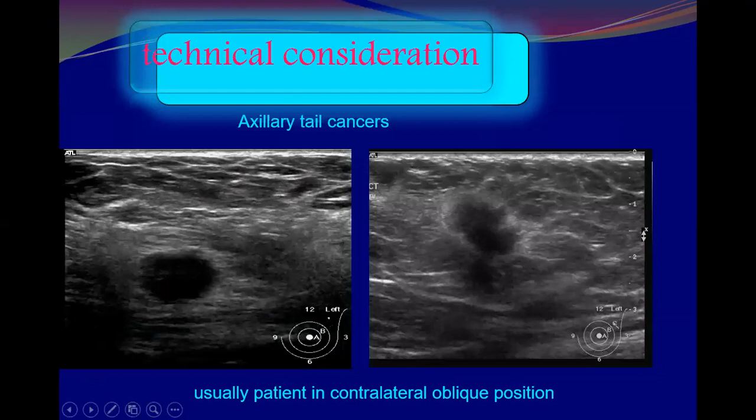You see here toward the axilla, and how can you differentiate between lesions in the axilla arising in an ectopic breast from a lesion in the tail of Spence, or the axillary tail? How could you differentiate that? We mentioned that before.